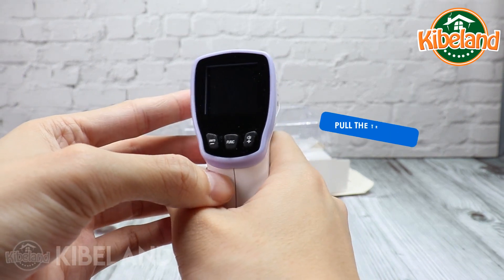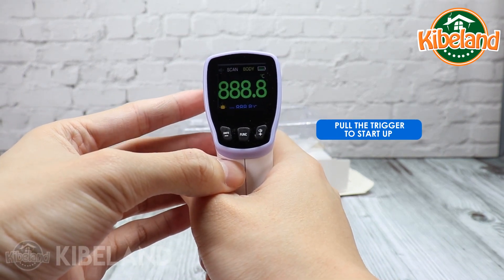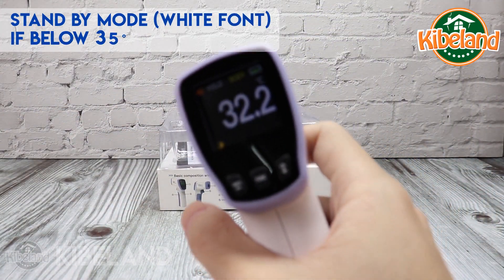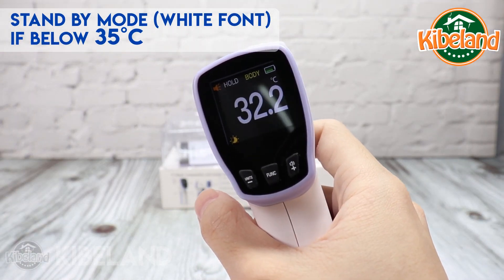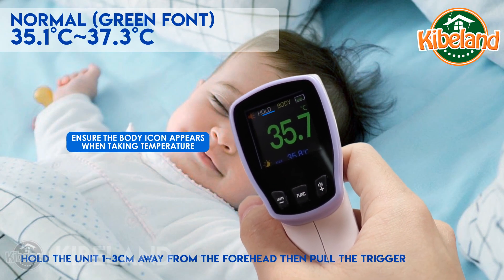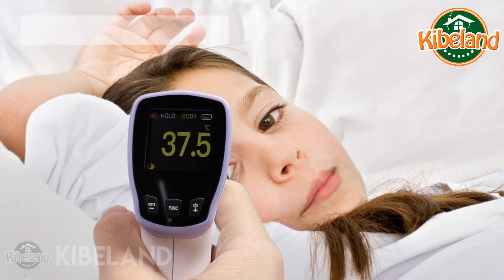Pull the trigger to start up the meter. If the temperature is below 35 degrees Celsius, the measuring font is white, which means you are in standby mode. From 35.1 to 37.3 degrees Celsius, the green font indicates normal temperature.